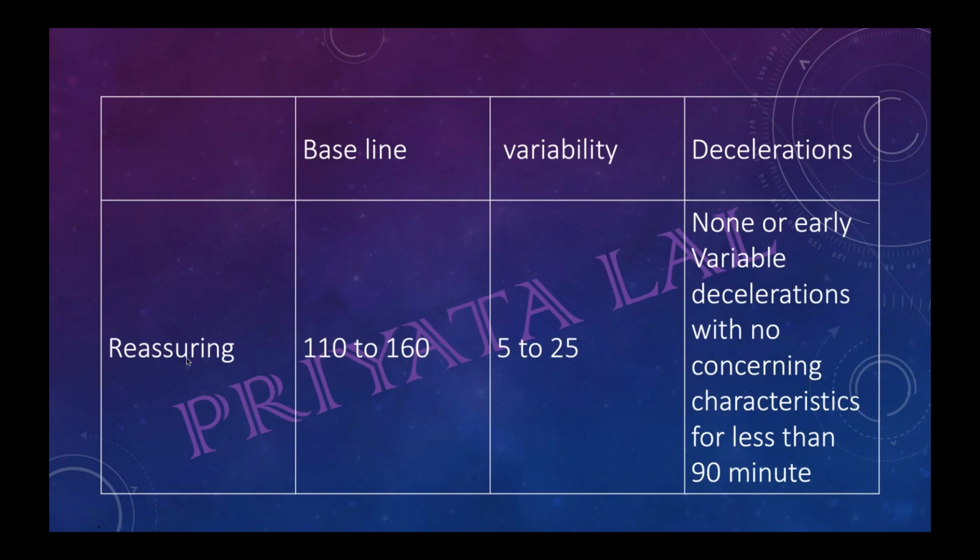This appears quite confusing. So therefore I made even a mnemonic for myself, because I used to make mistakes all the time. So if categorization, I will put under NSP. Okay, so this is feature. Many times people do their question wrong, because they have asked categorization and you tell feature. Sometimes they ask you feature and you answer from categorization. So please read your question well.